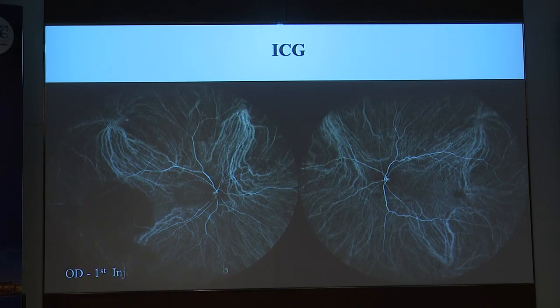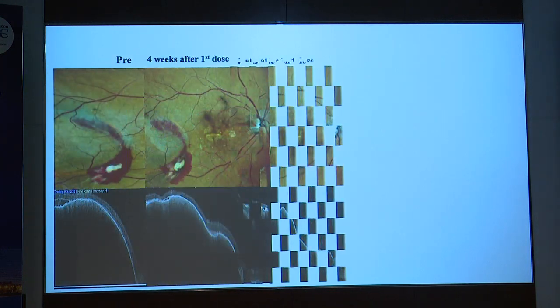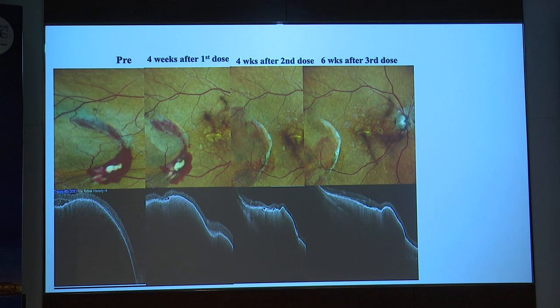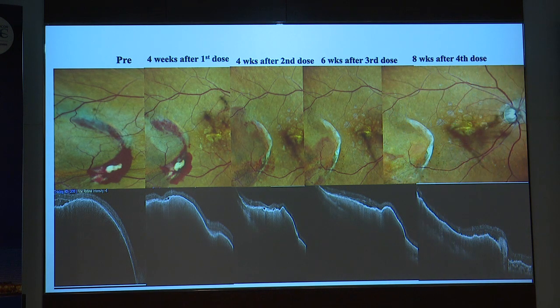And we did an angio, we treated, and this is how we can follow up. You can see the tumor coming down in height for yourself. This is how it happens.